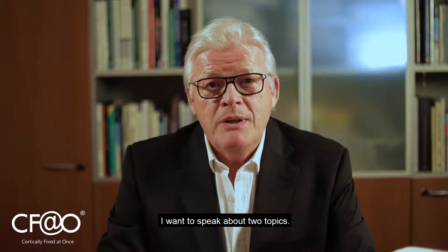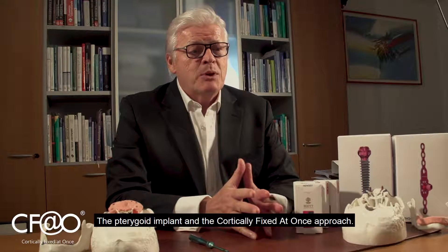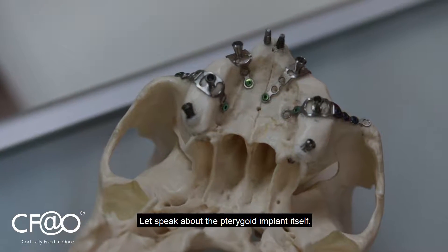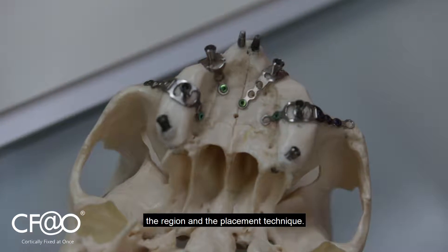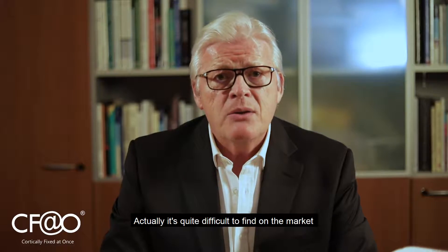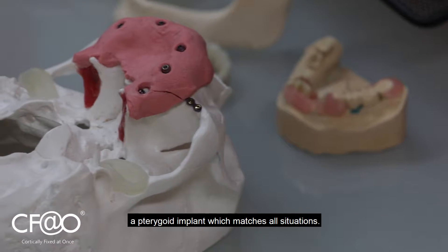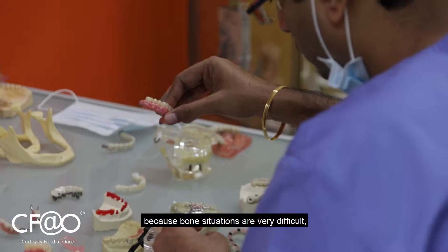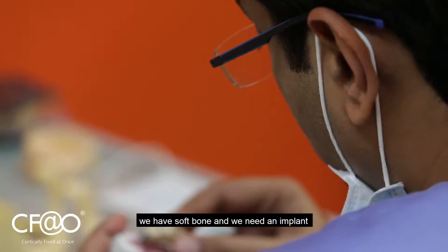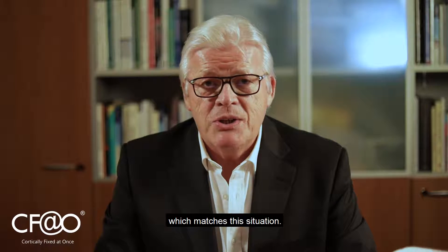I want to speak about two topics: the pterygoid implant and the cortically fixed advanced approach. Let's speak about the pterygoid implant itself, the region, and the placement technique. It's quite difficult to find on the market a pterygoid implant which matches all situations, because bone situations are very difficult. We have soft bone and we need an implant which matches this situation.